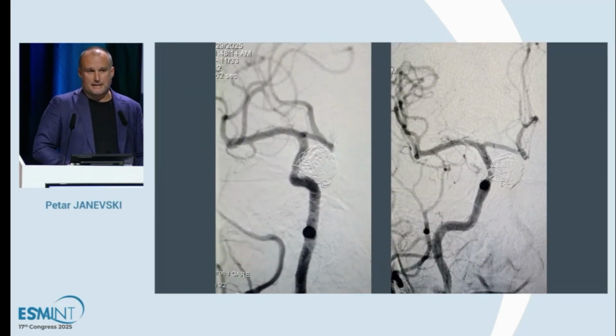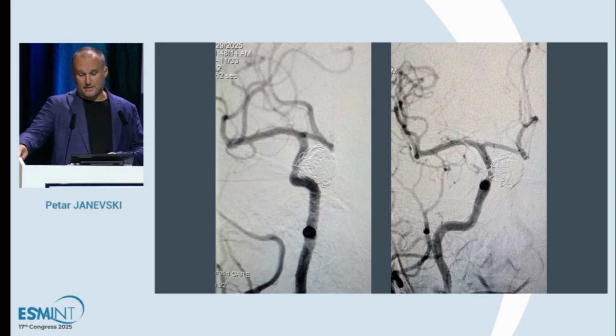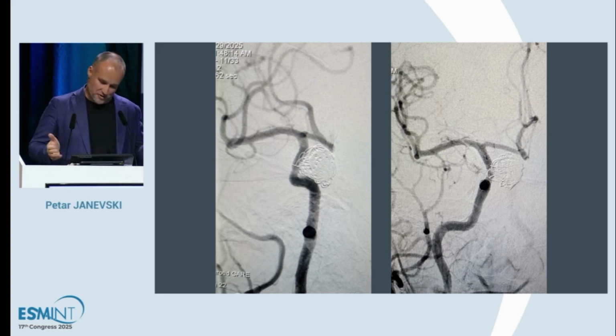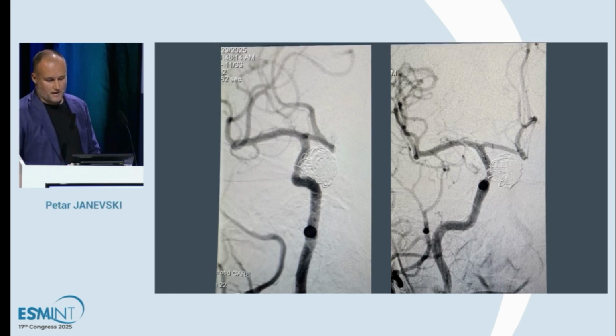In conclusion, I can say that thromboembolic complications can happen, of course, during embolization of ruptured aneurysms. That's expected, especially when you use bare metal devices as a support. And as this case showed, it can happen during elective cases with prepared patients, but usually they don't happen in the same patient twice, usually. But this was the case. So we have to be prepared for everything and have our bailout strategies prepared in advance. Thank you for your attention.